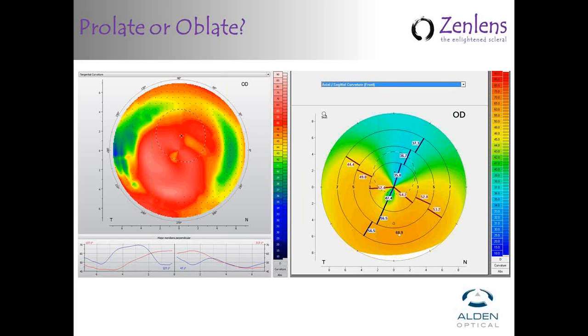The image on the right is actually a patient who has keratoconus or maybe pellucid marginal degeneration, depending upon at what point you transition from calling that patient keratoconus to pellucid. Needless to say, it's lumped together in a corneal ectasia category. And the map on the right was a patient actually in our clinic here who was originally fitted with a prolate design, but as you look at the topography, you can see centrally the K readings we're getting there are 35.8 by 47.4 in one meridian, the other meridian 52 by 54. If you go down to the bottom of the map, you see the hot spot there is at 60.9, I think. And so that, again, indicates that the area of greatest curvature is actually out toward the periphery.